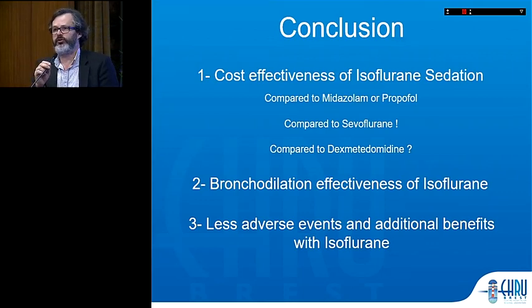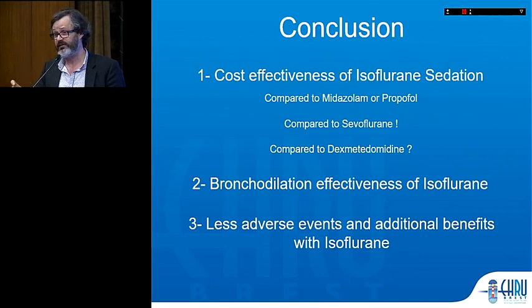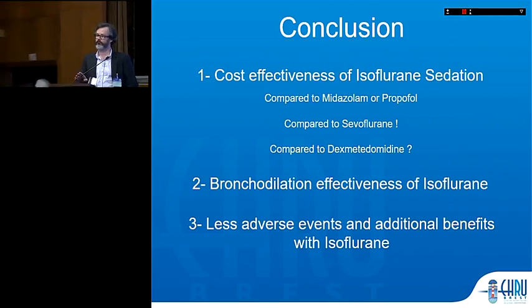Yeah, there should be some pollution, but very, very low. We also use a closed-suction system, and it was monitored in the ICU room by Peter Sake, just like in the operating theater, at 1.2 ppm. So, Professor Kale, did you have something to add to this?